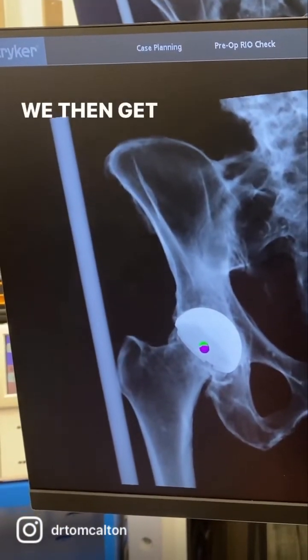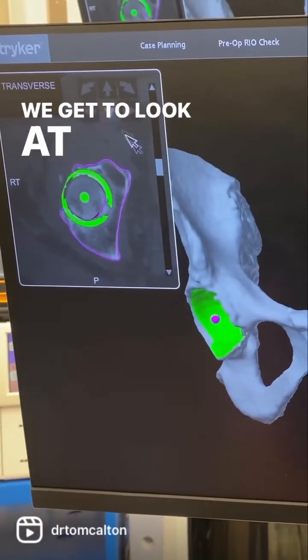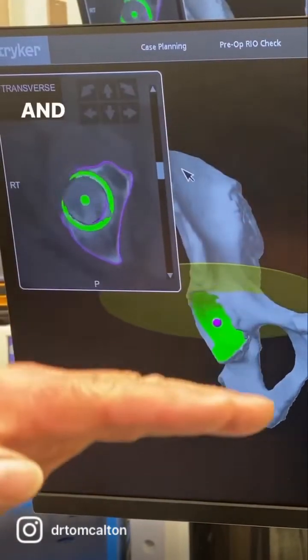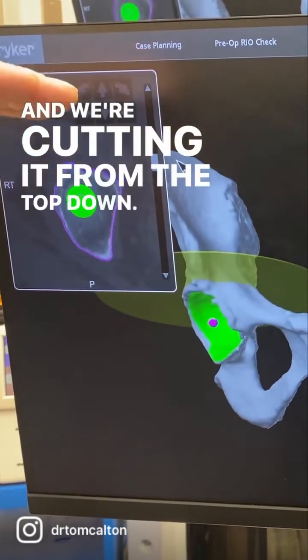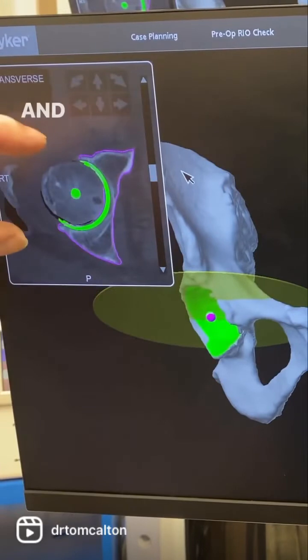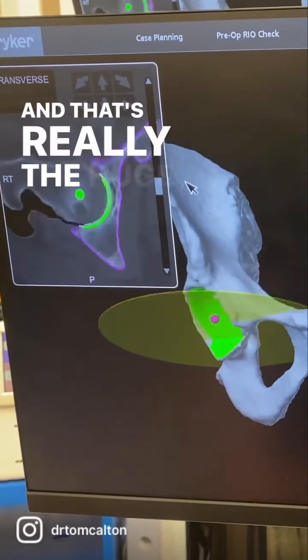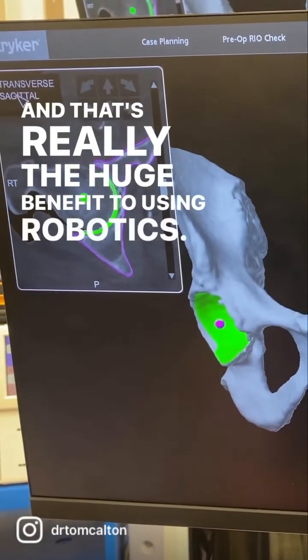We then get the option of looking at the preparation of the reaming. We get to look at it in a transverse view, so we're going from top to bottom and cutting it from the top down. There's the top. Here we go through the anterior and the posterior walls, and the ream will be guided by the MAKO robot, and that's really the huge benefit to using robotics.